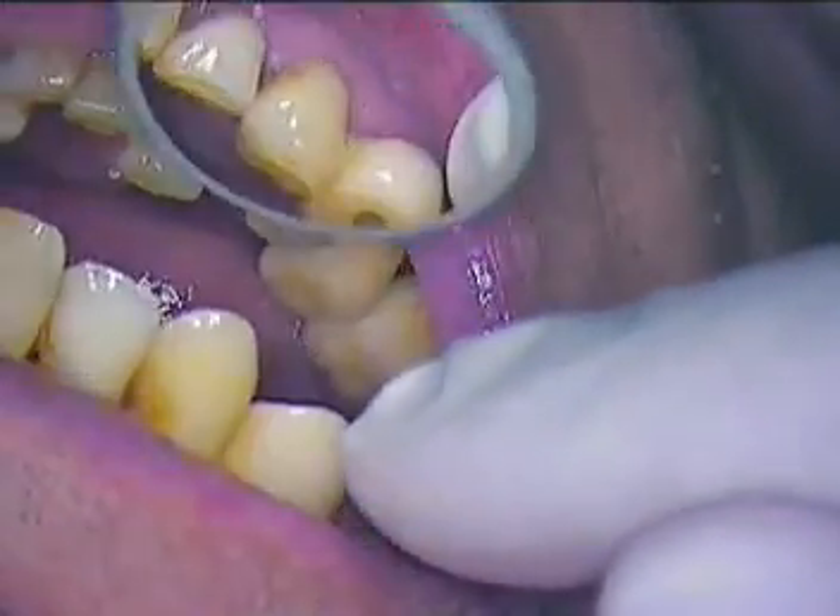We're here live in Boca Raton. I'm Dr. Jerry Cuomo. Today's assignment is a bone level implant.